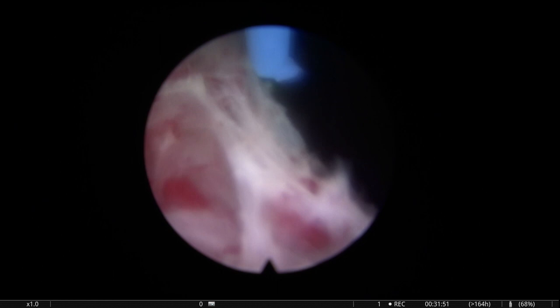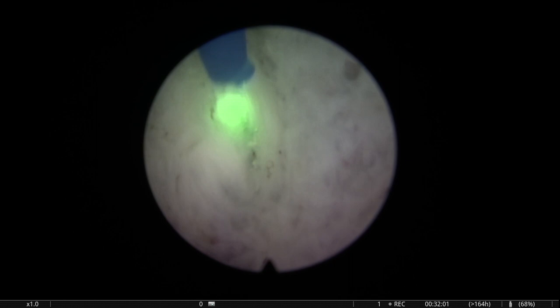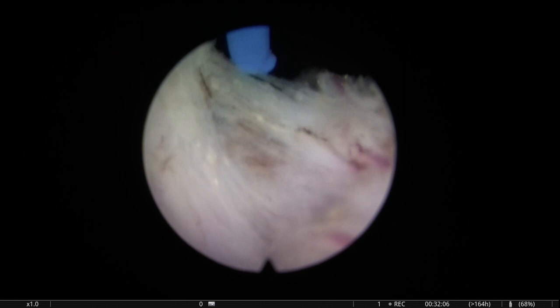You know, at 2.2 joules, this would be the caliber of the bullet. And so if you have a machine gun that fires many more bullets, of course, you're going to cut the tissue much faster. It's only logical.